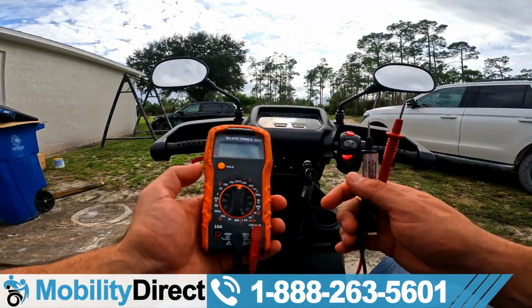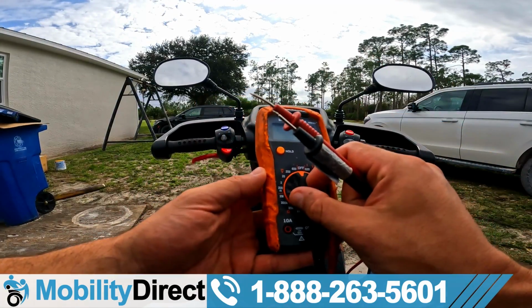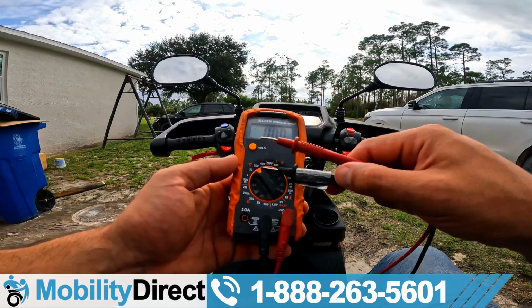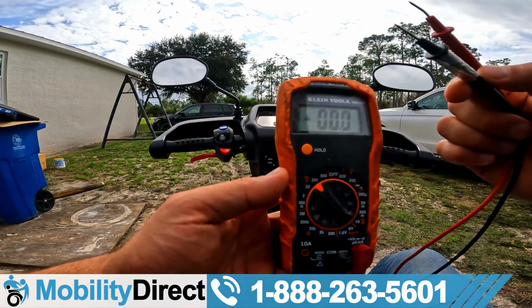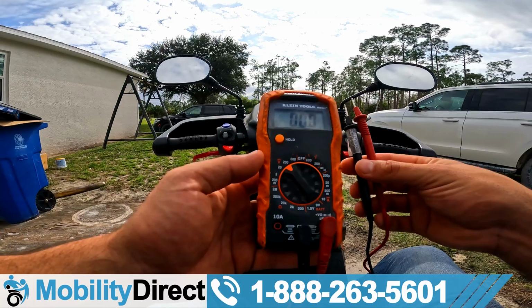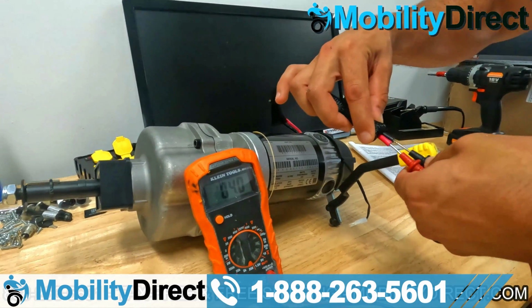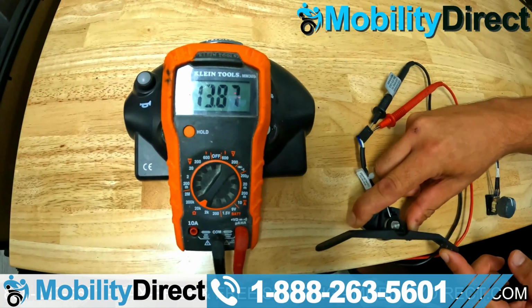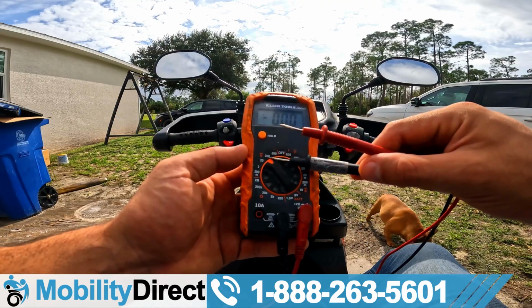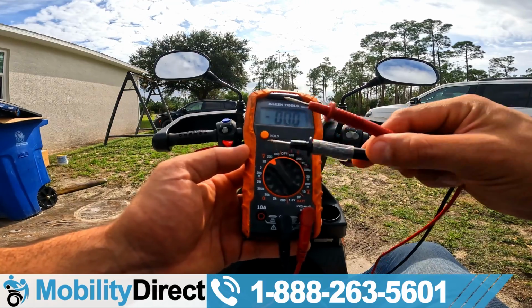All right, folks, so what I want to show you is how you can check your battery voltage using a voltage meter or a multimeter. In this case, I have a Klein Tools multimeter, and I'm going to check the voltage. So I put it on here to voltage set at a maximum of 200. And you should really have one of these if you're going to do any kind of troubleshooting on electronic devices. It really helps. We have a ton of videos where we troubleshoot motors, controllers, ignitions, throttles, all using a multimeter and putting it in the ohms resistance measurement setting down here. But for this test, we're just going to test voltage. So I've got it on a maximum of 200. You can't use 20 because it goes up to 24 volts, so it'll show an overload. So we put it up to 200.